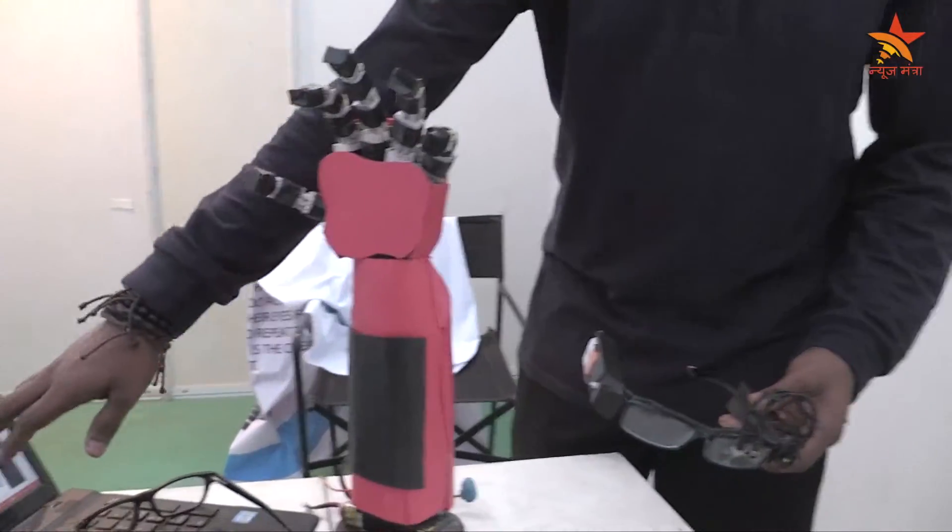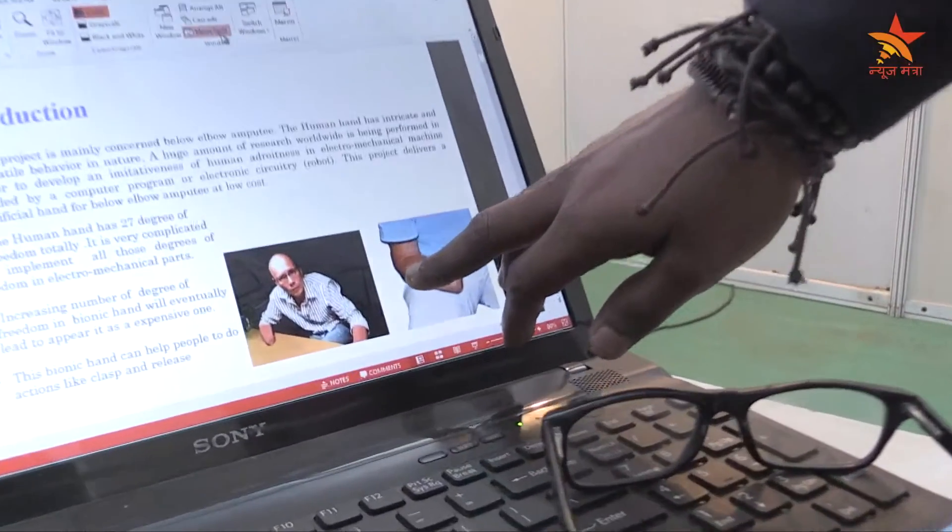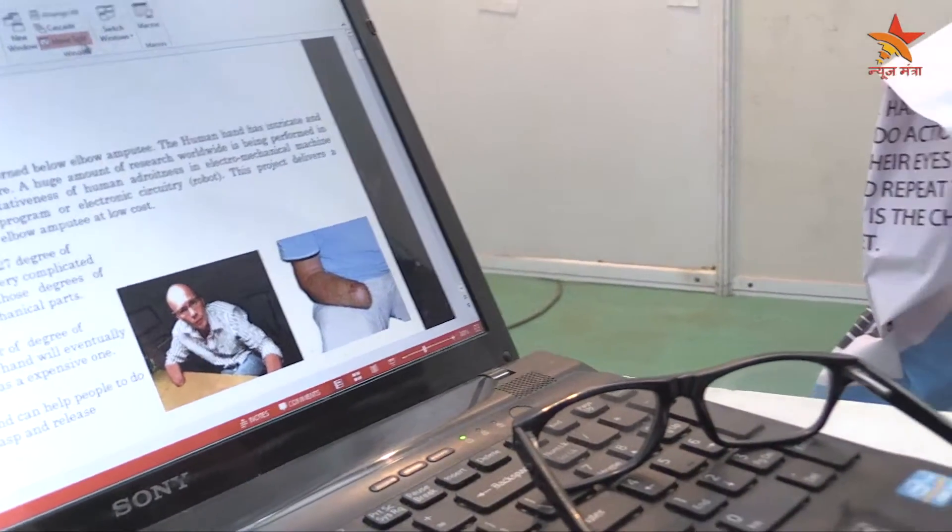This is mainly for the people like the one you see here. There is a removal of hand from the body — we call them as below-elbow amputee people.